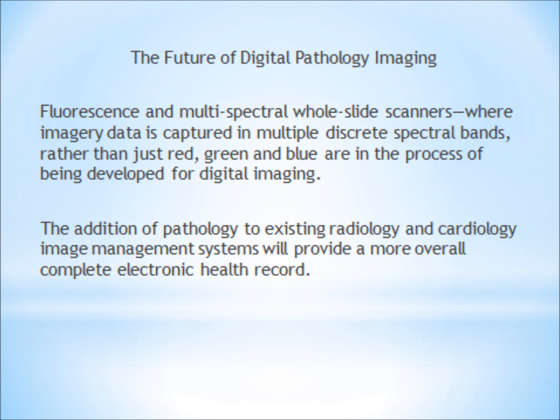So what about the future of digital pathology imaging? Well, for starters, there are some scanners that are being worked on currently. The data is captured in multiple spectral bands, and these bands are in the process of being developed for the digital imaging, so that's going to be extremely helpful in the future.